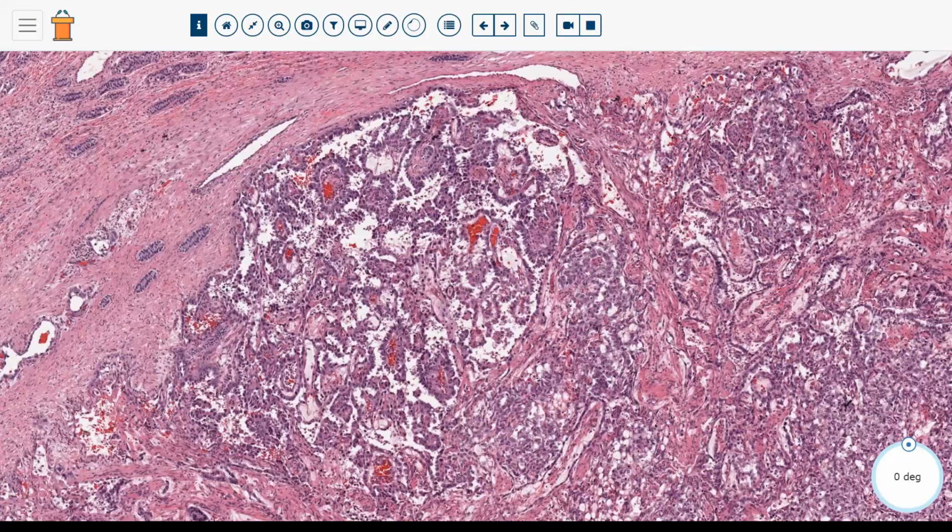The prepubertal type of germ cell tumors, like the one that we're looking at here, do not have that same molecular pathogenesis, and they do not derive from the precursor GCNIS. And the two main types of prepubertal germ cell tumors that you can have are teratoma, pure teratoma, and pure yolk sac tumor. So in adults, it's quite rare to have a pure yolk sac tumor, but in prepubertal germ cell tumors, the two main types are frequently pure, and they are teratoma and yolk sac tumor.